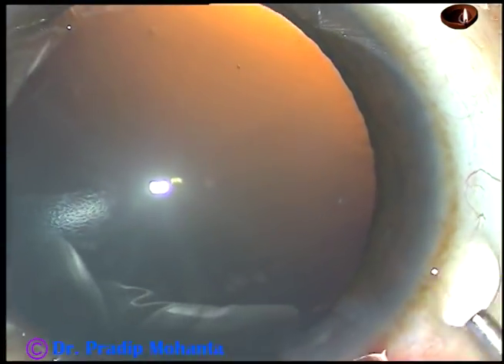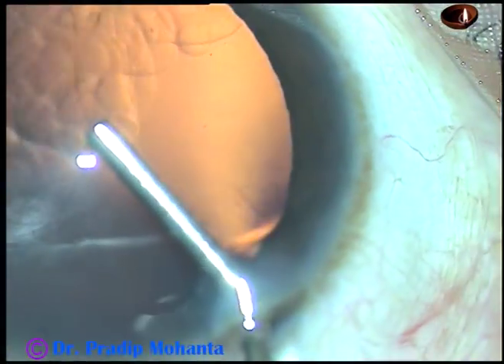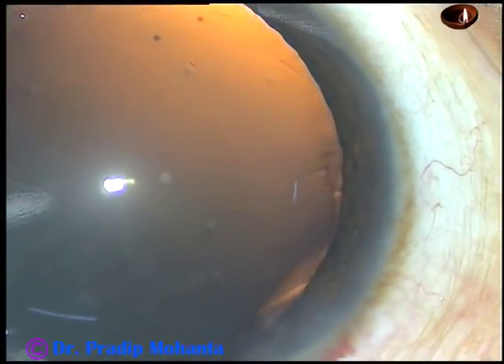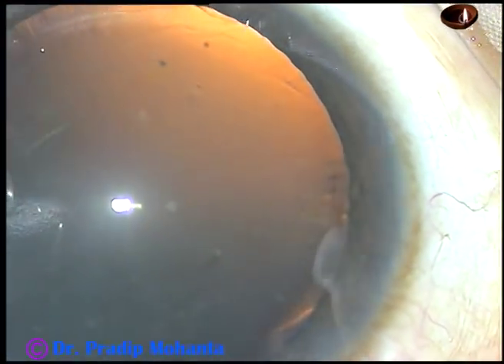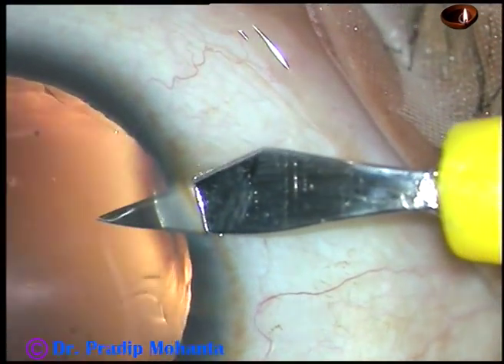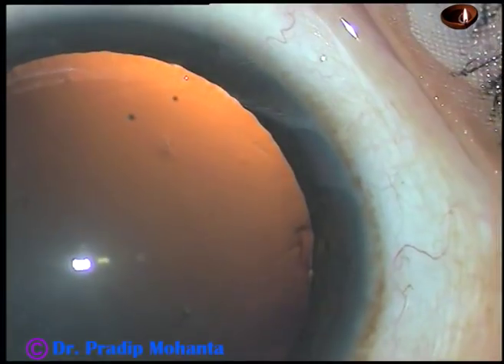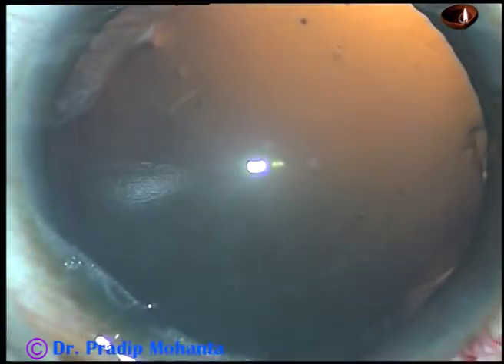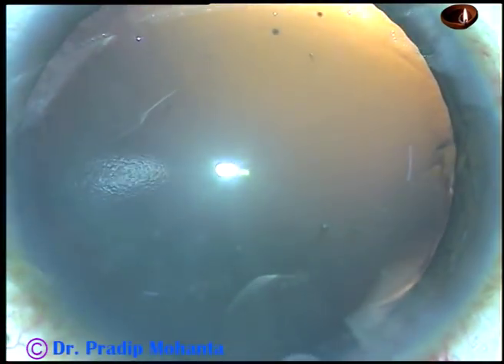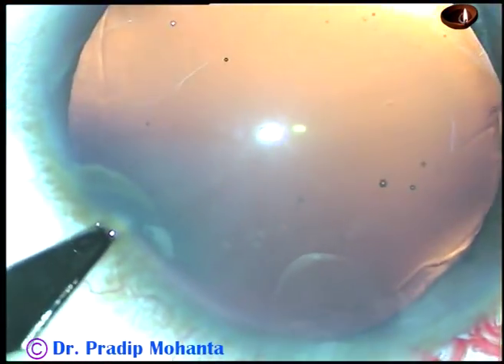By this time, the main incision has been made. Viscoelastic substance is being injected into the anterior chamber now. This is one side port on the right side of the main incision, and this is another side port on the left side of the main incision.